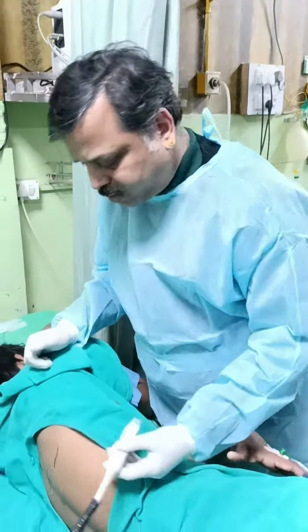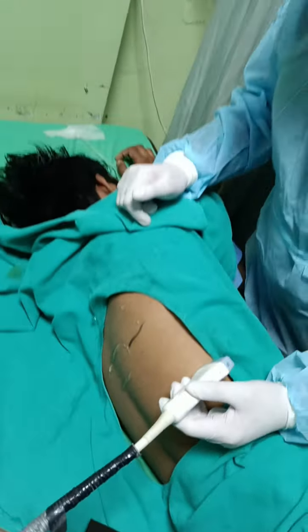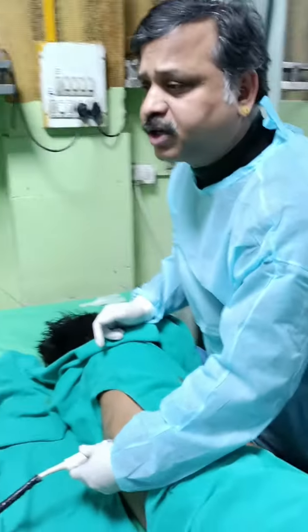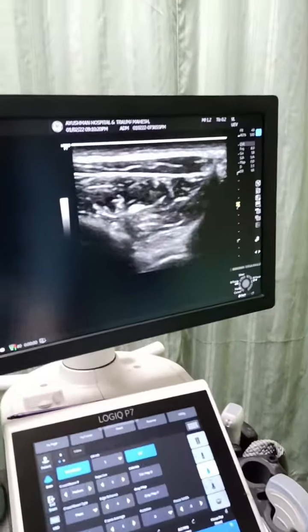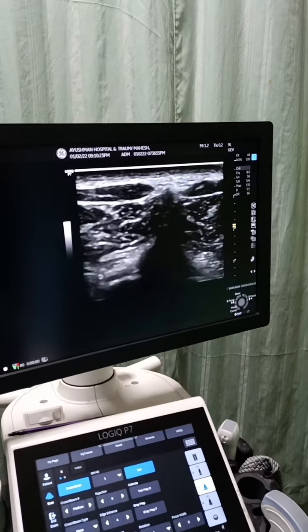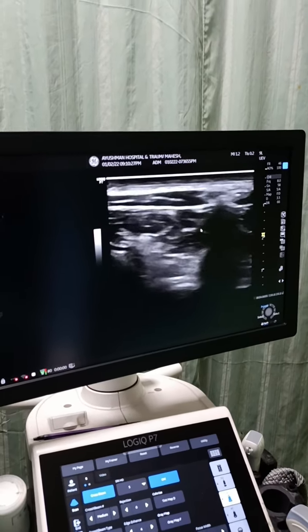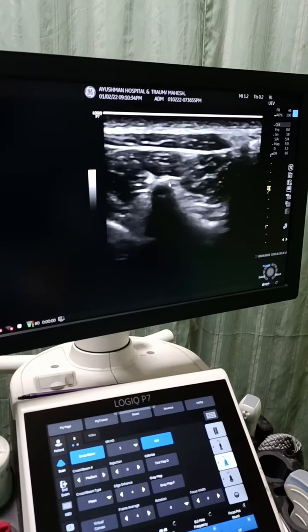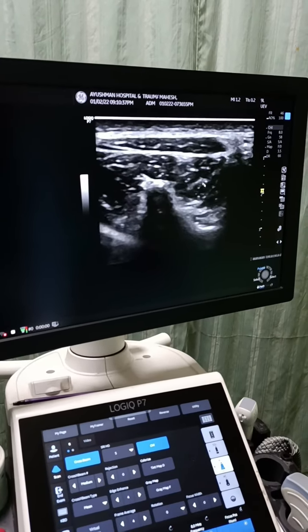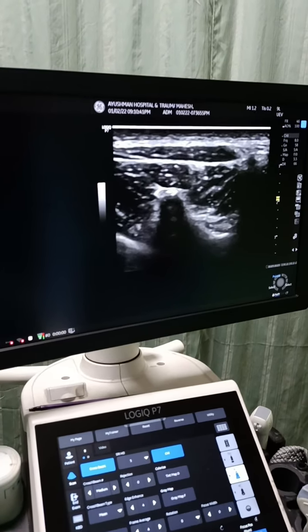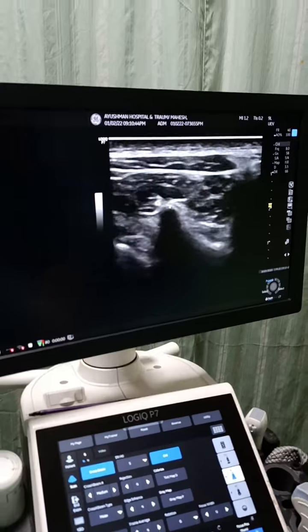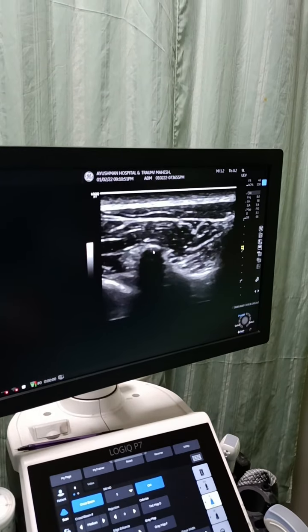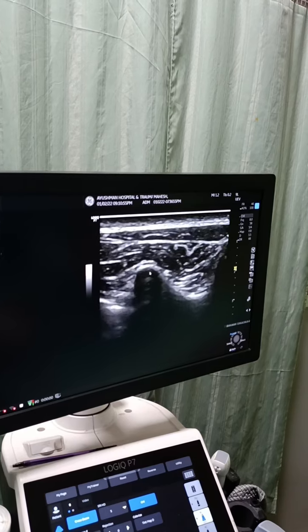Going through the sono-anatomy, I have marked with a sterile marker and I will be going at the T10 level. If we keep our probe, this is the spinous process, and if you move the probe, this is the transverse process. These are the erector spinal muscles. We have to lift this muscle from the transverse process — this is a fascial block. This is our target point where we will be inserting our needle and lifting the erector spinal plane.